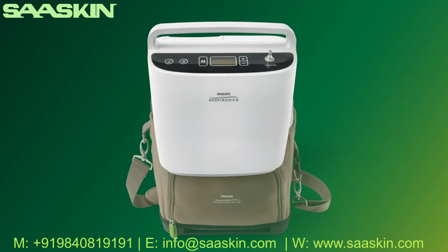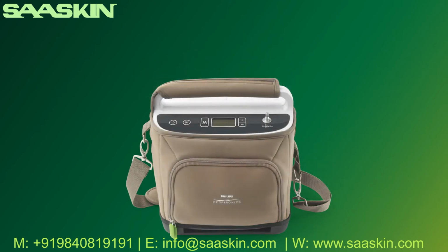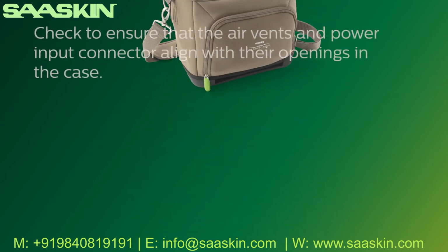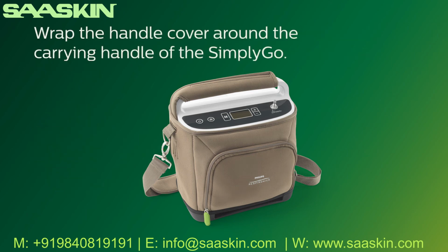Insert the device into the top of the bag and pull the snugly fitting bag up around the device. Check to ensure that the air vents and power input connector align with their openings in the case. Finally, wrap the handle cover around the carrying handle of the SimplyGo and secure it in place by pressing the two Velcro together.